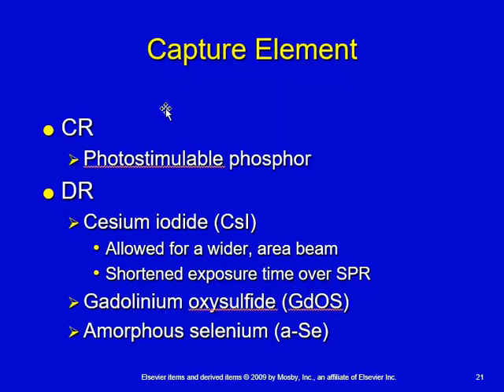In your CR, in your DR, it's your cesium iodide. And we've been through that. It allowed for a wider area beam, shortened exposure time over scan projection radiography, and it could be gadolinium oxysulfide or amorphous selenium.